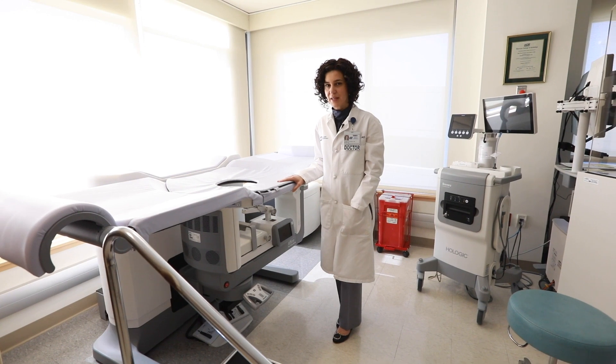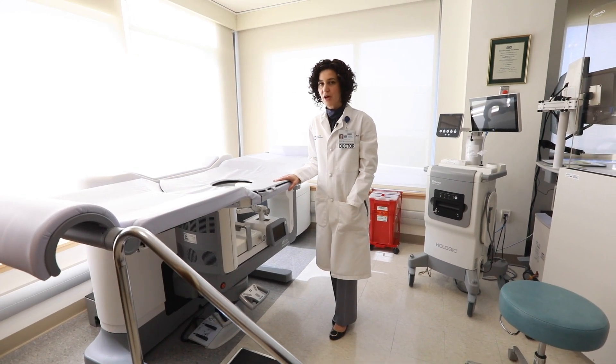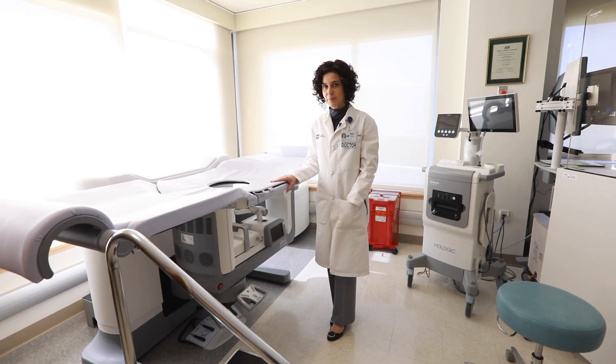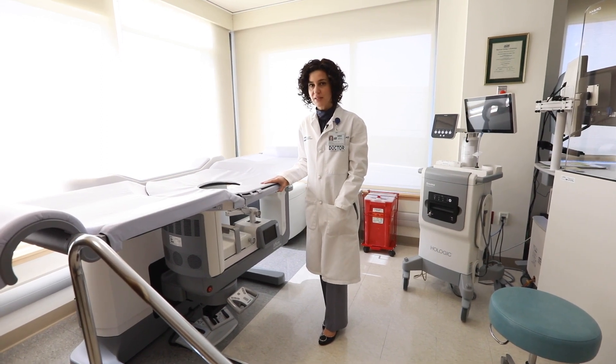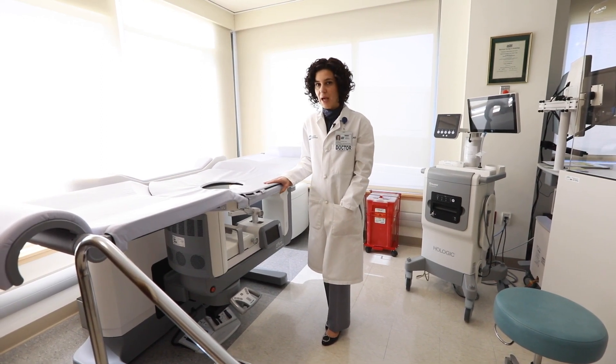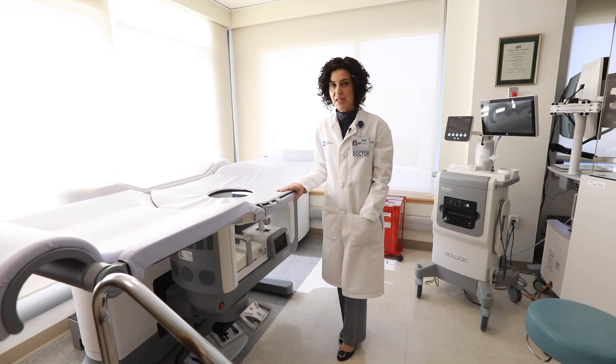Hi, I'm Dr. Marina Feldman at the Elliott Breast Health Center. Your doctor may have recommended a stereotactic biopsy. There is a video that explains what the biopsy entails and what to expect. Here I want to introduce you to what the stereo table looks like.